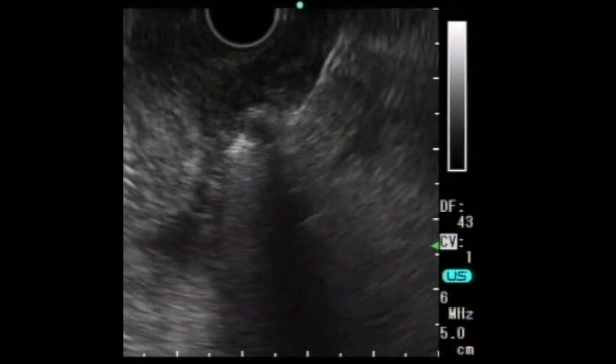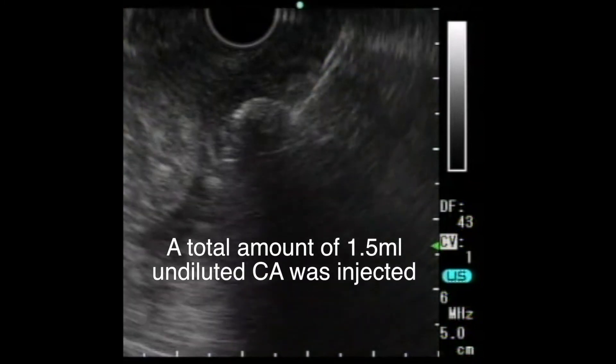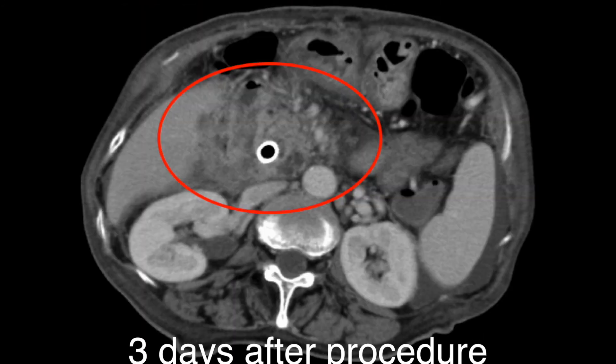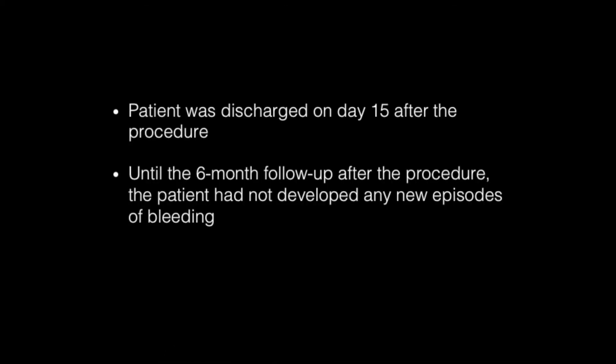A total amount of 1.5 ml of undiluted cyanoacrylate was injected. On day 4 after the procedure, CT scans showed the disappearance of contrast enhancement inside the varices. The patient was discharged on day 15. After 6 months follow-up, the patient had not developed any new episodes of bleeding.